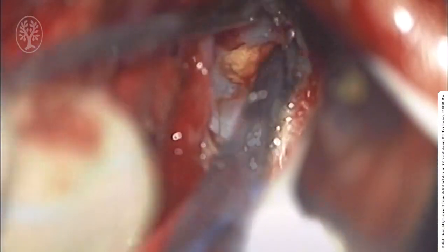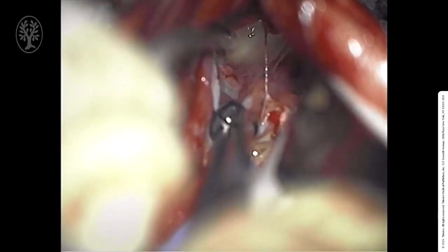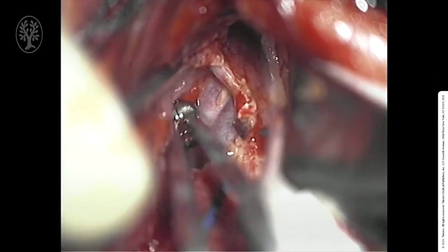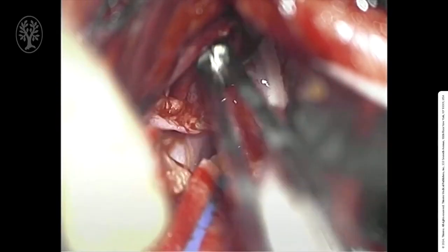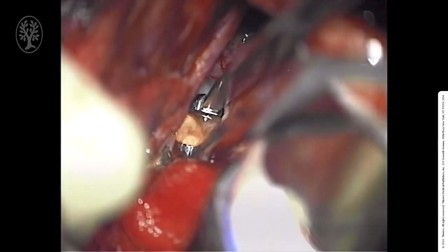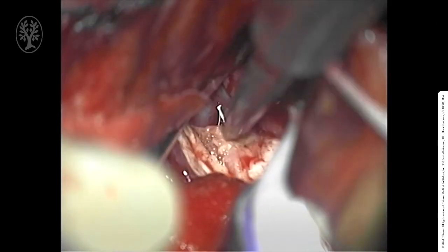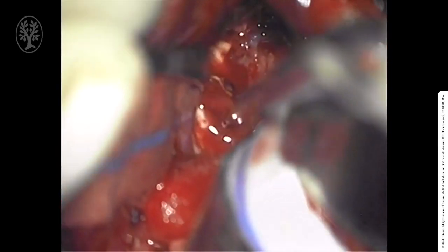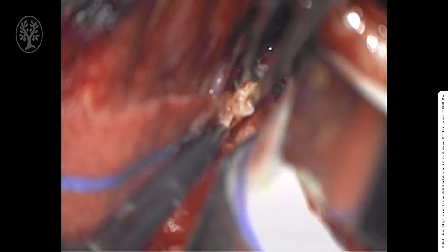We began to remove the cyst wall in pieces while dissecting it away from the surrounding structures and rolling it into itself. Branches of the internal cerebral vein could be seen running through the inferior portion of the cyst. We continued to remove the cyst wall using a combination of sharp and blunt dissection, as well as cavitational aspiration.